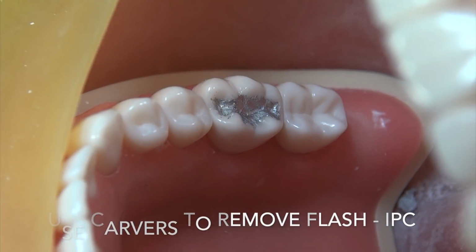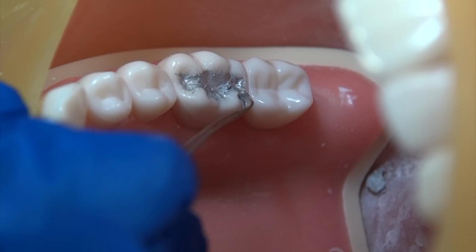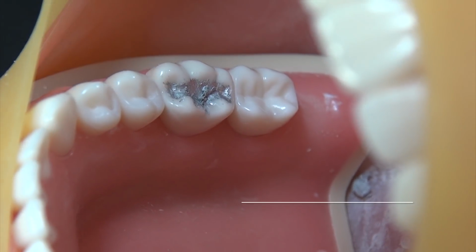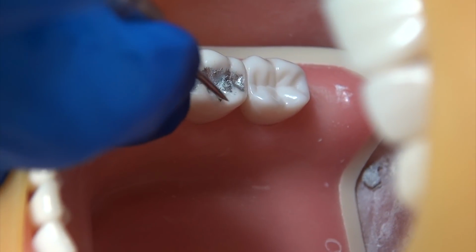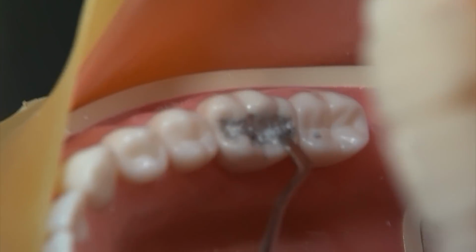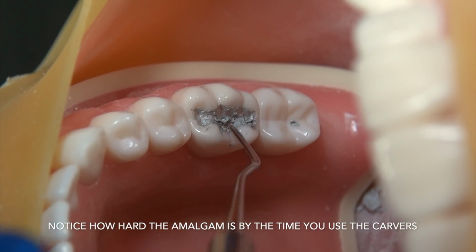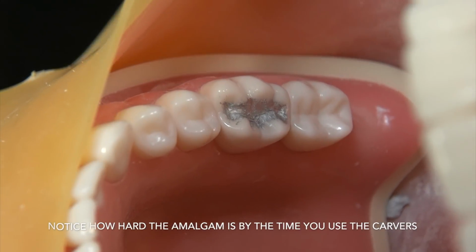This is where some of the carvers really come into play. This is an IPC. And so see how I'm going from the natural tooth structure down. So I really like this one. I like it particularly for going from natural tooth structure down to the central groove.